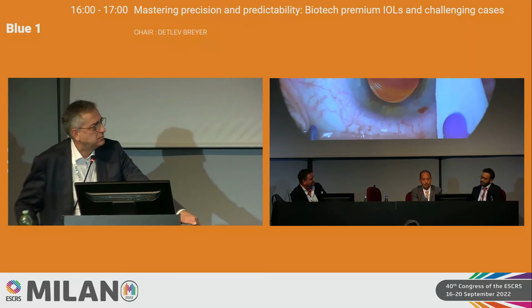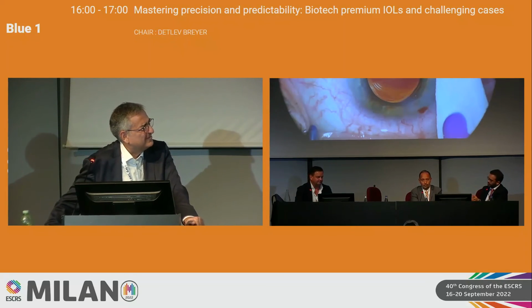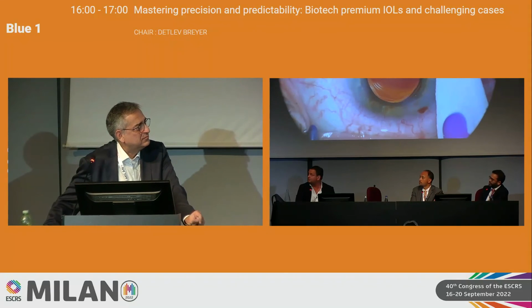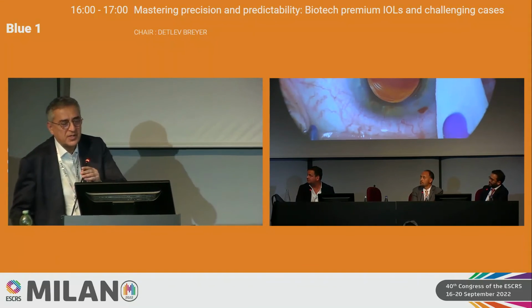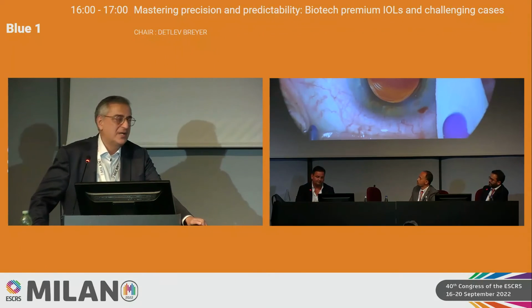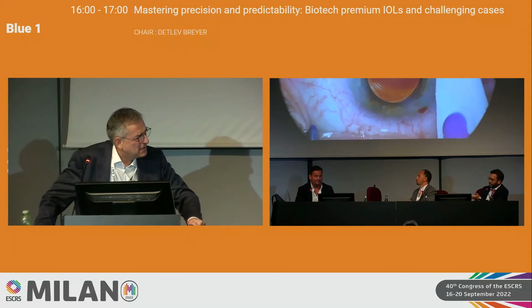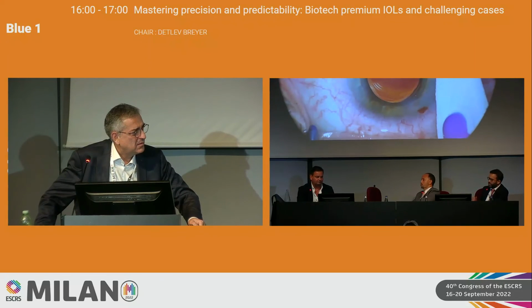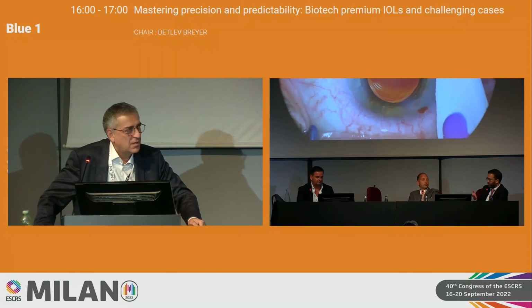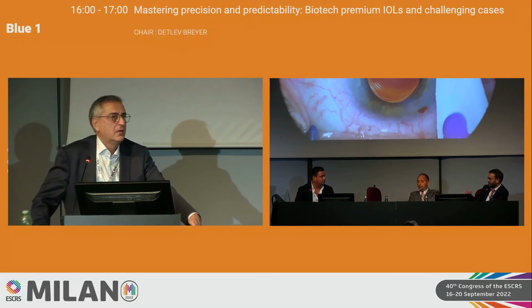Final word. In terms of, have you used the EDOF as well? Do you use both lenses or just the trifocal? Do you use the EDOF version as well, the extended depth of focus one? No. This is not a comparative study. We just give the results of our clinical experience for trifocal IOLs. Yeah, because my experience is when you're comparing between the two, sometimes you do mini monovision with the EDOF, but with all the trifocals, if you choose a patient right, then they do very, very well, much better than the EDOF group.